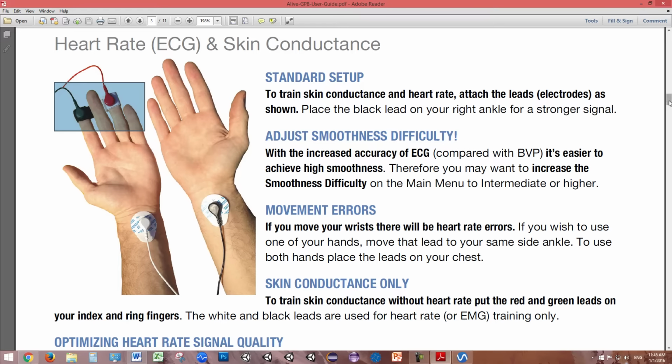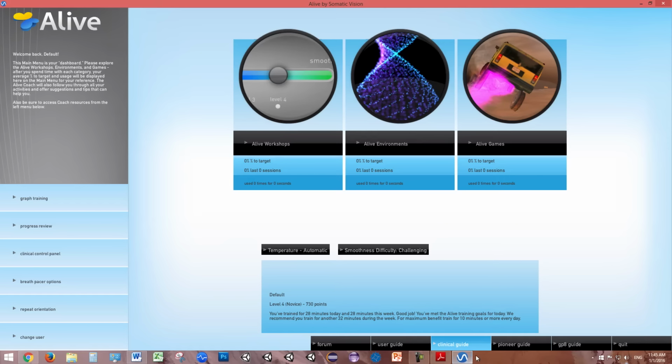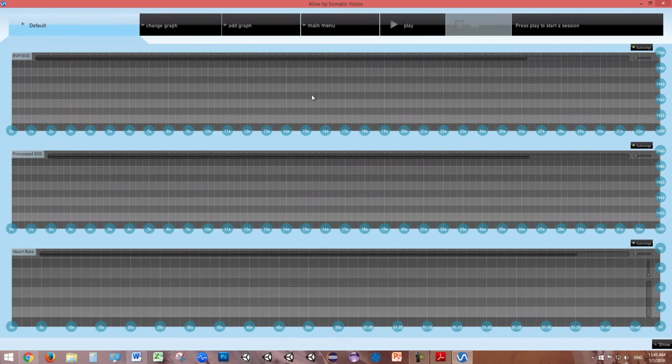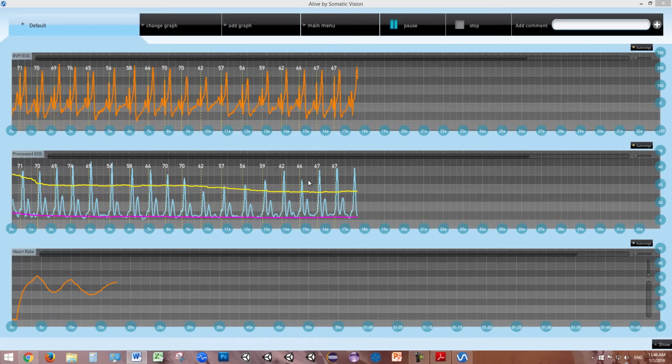If you're new to ECG training, it's good to check the signal quality. From the Alive main menu, choose Graph Training, and then change the graph to the raw BVP ECG signal quality graph, and hit play. If the processed ECG clearly shows light blue spikes that are rising above or near the yellow line, we have a good, accurate heart rate measurement.